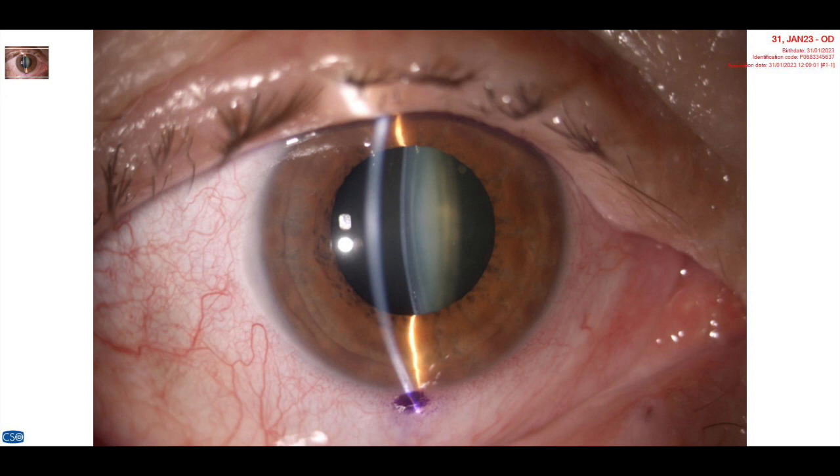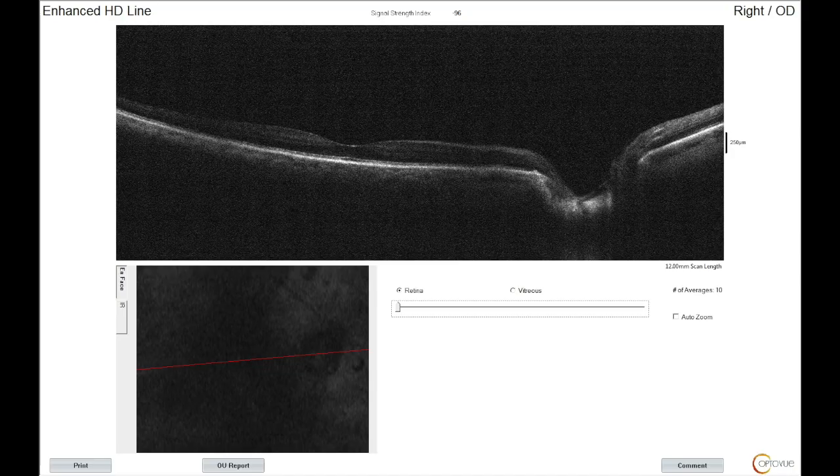Hi, this is John Canelopoulos from our center here in Athens, Greece — the Laser Vision Ambitore Surgery Center. We can see here a cataract that otherwise looks relatively normal. See how the lens is firm with the iris; macula is good. This patient is monocular — the other eye is amblyopic.